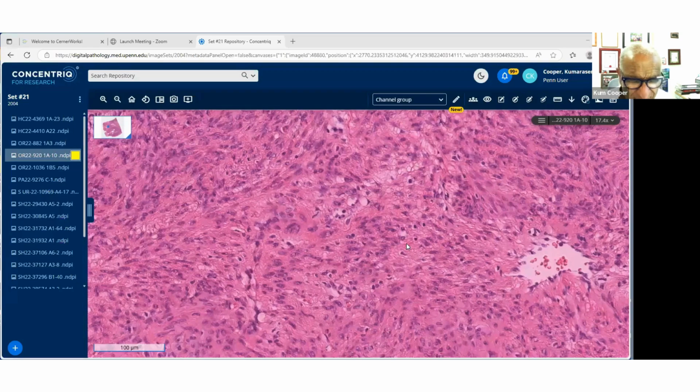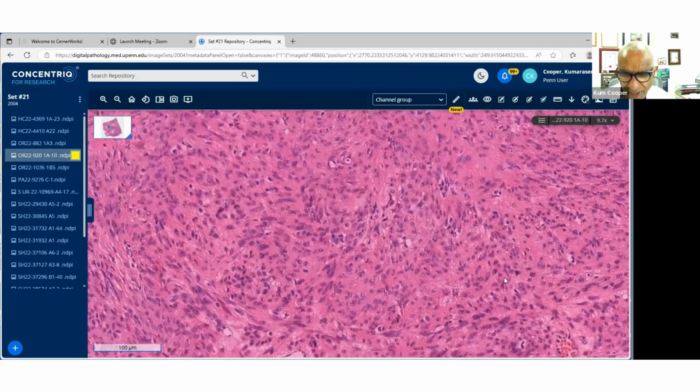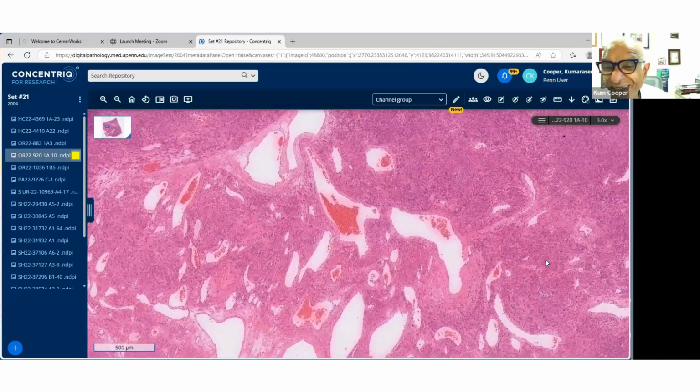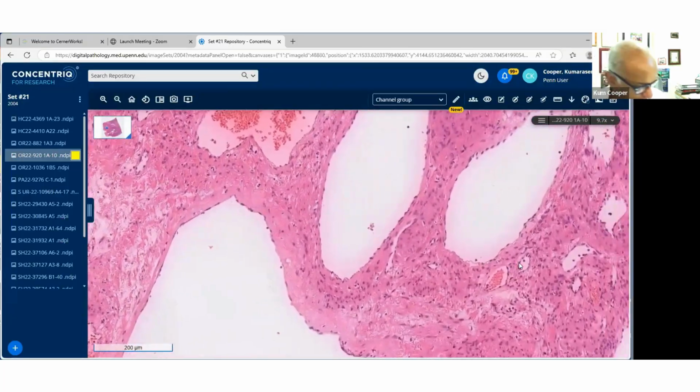Okay, so I answered that question, and I've already got some excellent thoughts here. Smooth muscle neoplasm, endometrial stromal tumor, low-grade endometrial stromal sarcoma. Those are all good. I'm just trying to find you other morphologies.